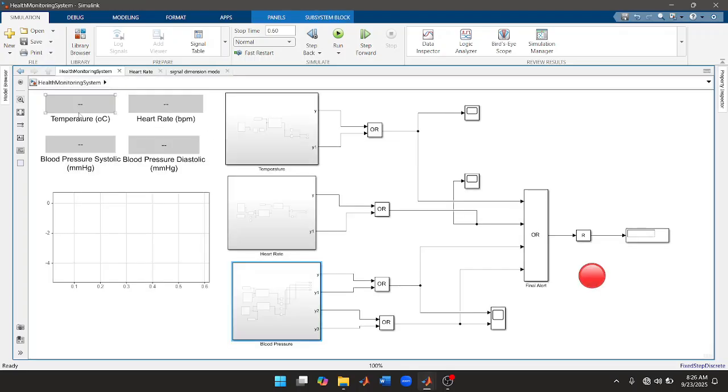Now, this display shows the signal itself: the temperature reading, the heart rate reading, the blood pressure reading, and so on. Then this will give us the waveform. Then this signal button is going to tell us if the temperature is above normal. If any of these vitals are above normal, you are going to have a red alert here. Now, if they are all normal, we have a green alert here saying that they are normal.